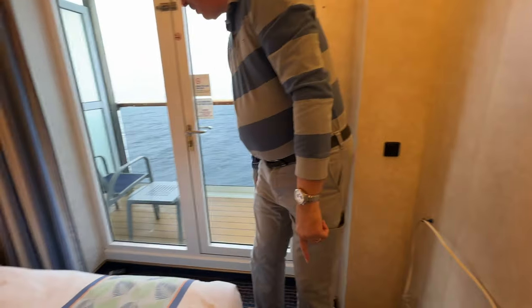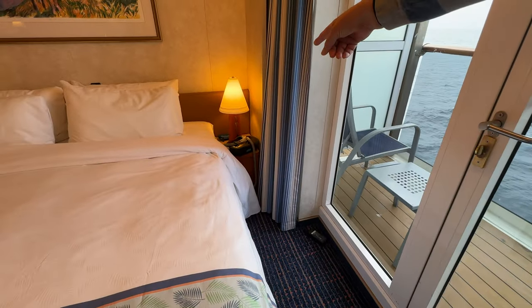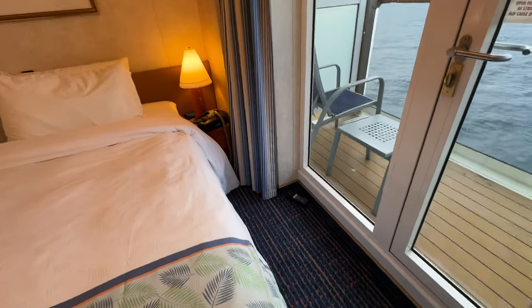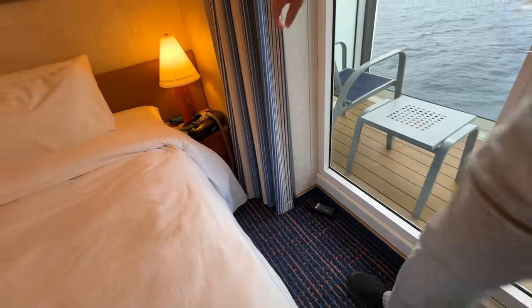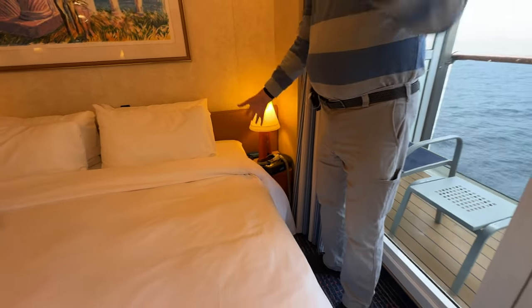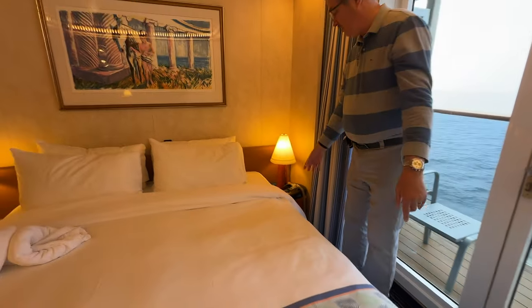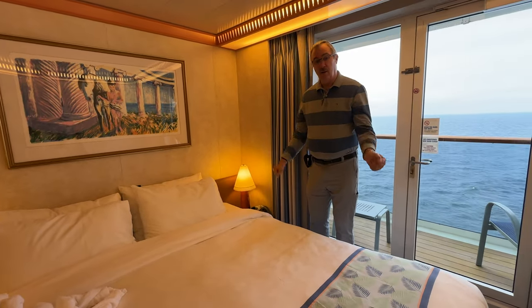That 15-foot length gets us all the way to the corner. The CPAP cable runs along the front of the balcony doorway to the actual CPAP device. I sleep on the right-hand side of the bed, so this is the longest distance we need to deal with. The CPAP is set up here and that part works just great.